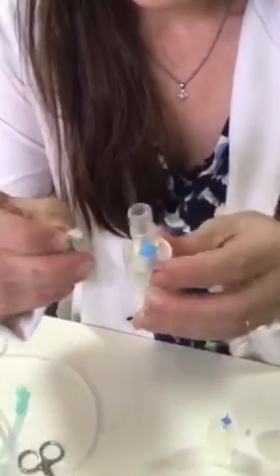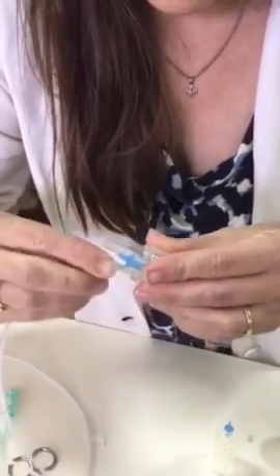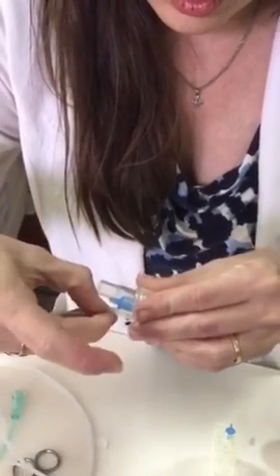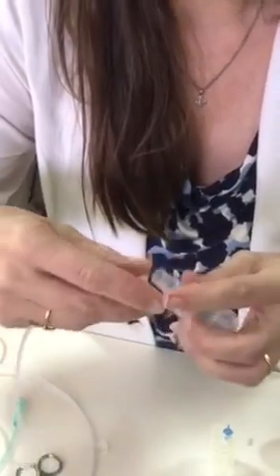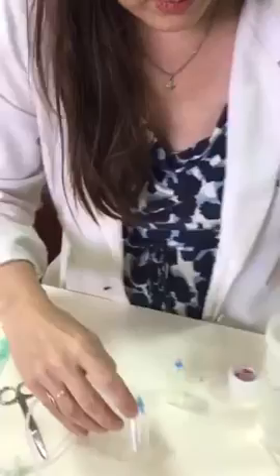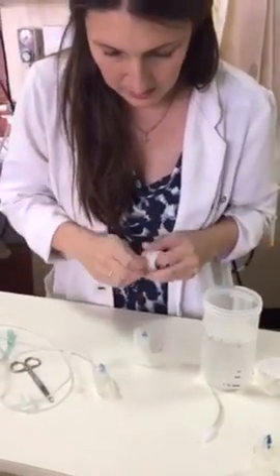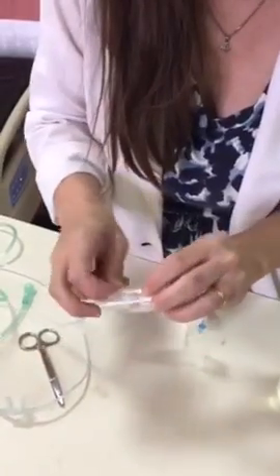Taking the end of this at the small part, you're going to slide that end of the nasal cannula tubing in and make sure it has a tight seal. Use as many layers of tape as you need to make sure there's no leak right here. Then take a small piece of tape and put it around the outside to hold it in place.